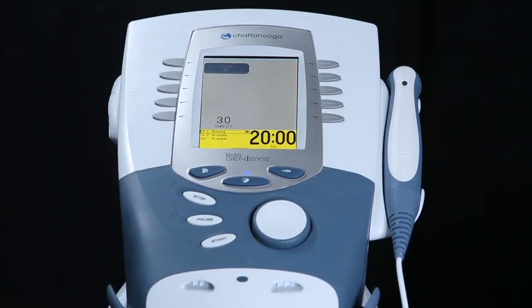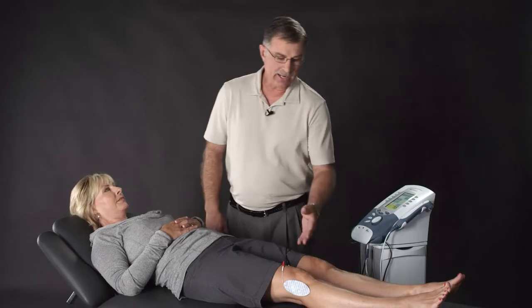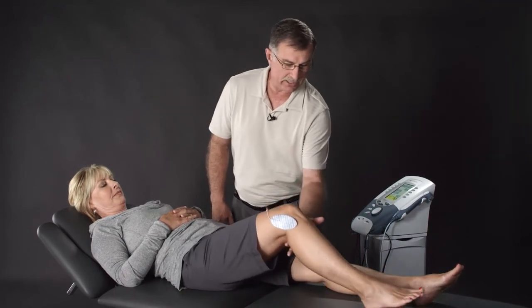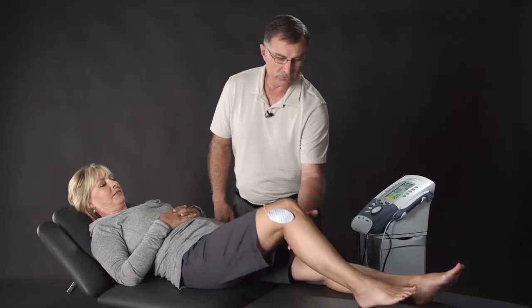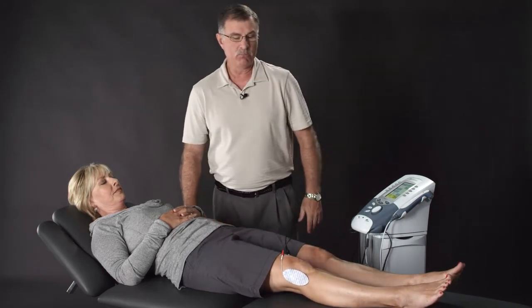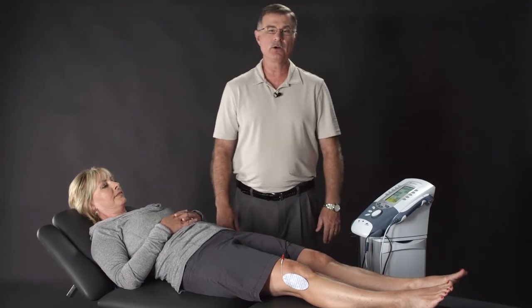We will press the start key, and then I like to have the patient move the part at this time. Just gently bend the knee and then straighten. Just some heel drags on the table. This will give us a little better outcome and will help us have longer lasting effects for our treatment.